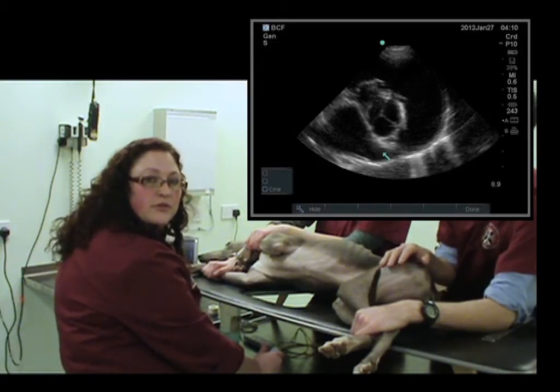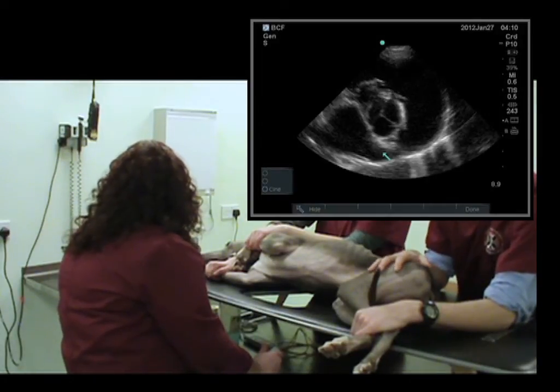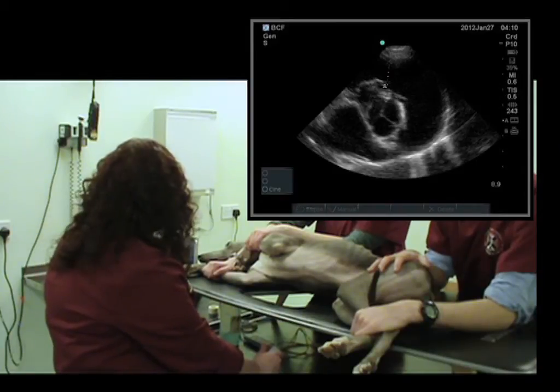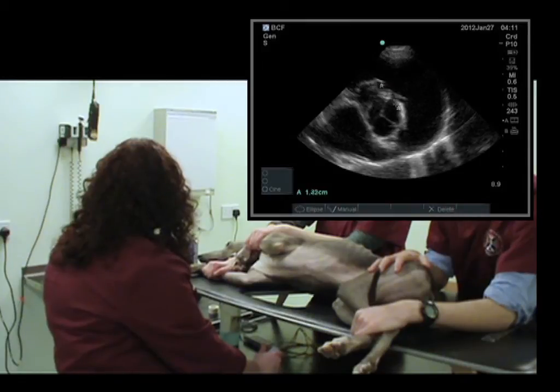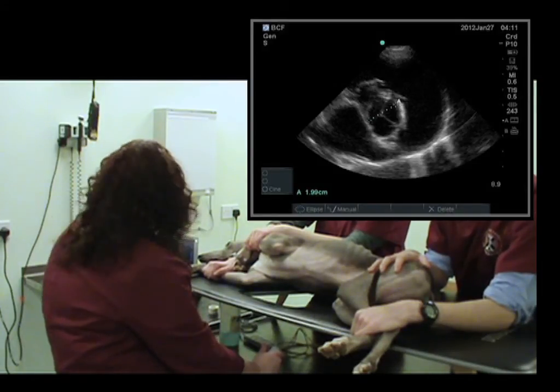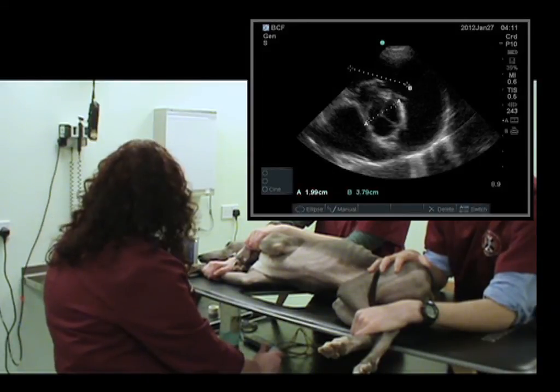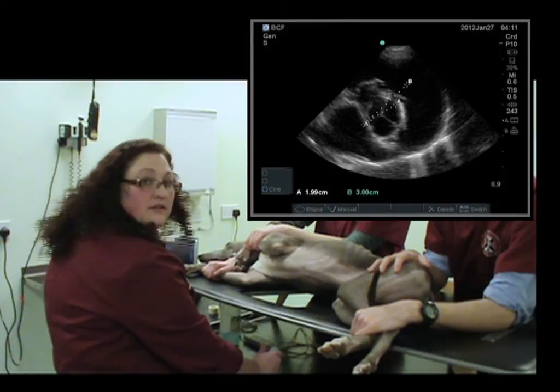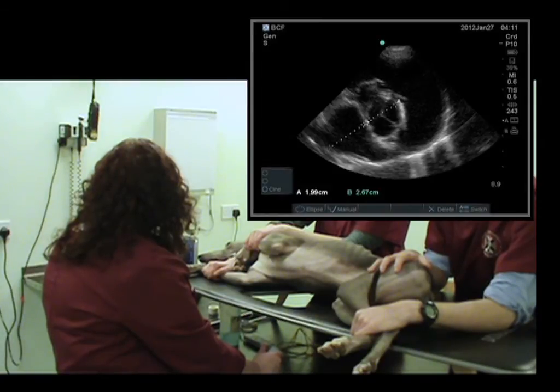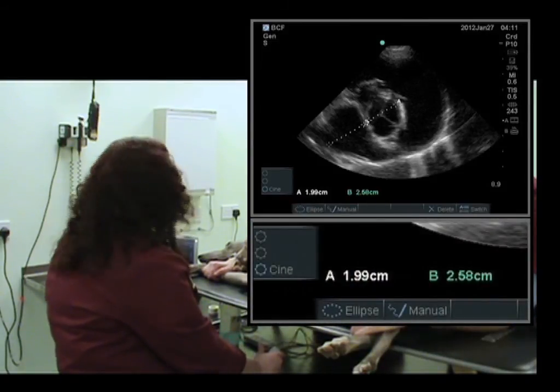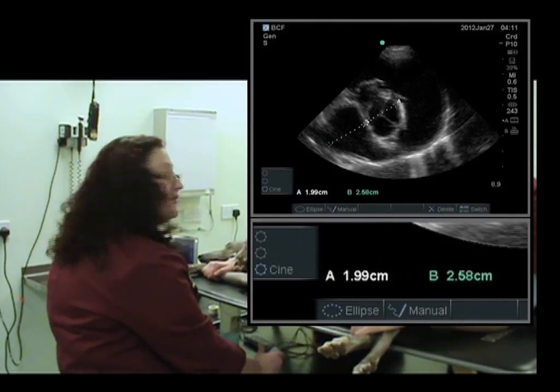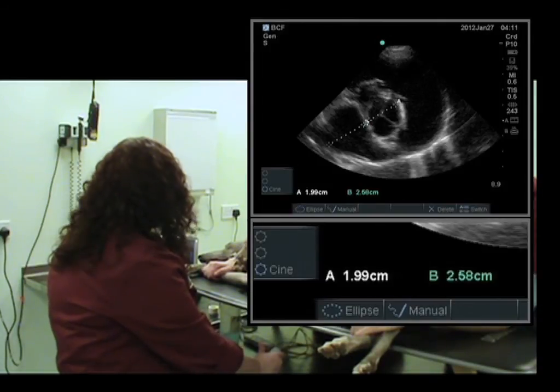What we can also do is perform a measurement with the ratio of the aorta to the left atrium. We start on one aspect of the aorta and measure down through, then measure the left atrium, staying in the same line and measuring through. On some machines, it will actually do this calculation for you. The normal ratio is less than 1.5 in a normal dog, which is the case in this dog — so this is a normal left atrium to aortic ratio.